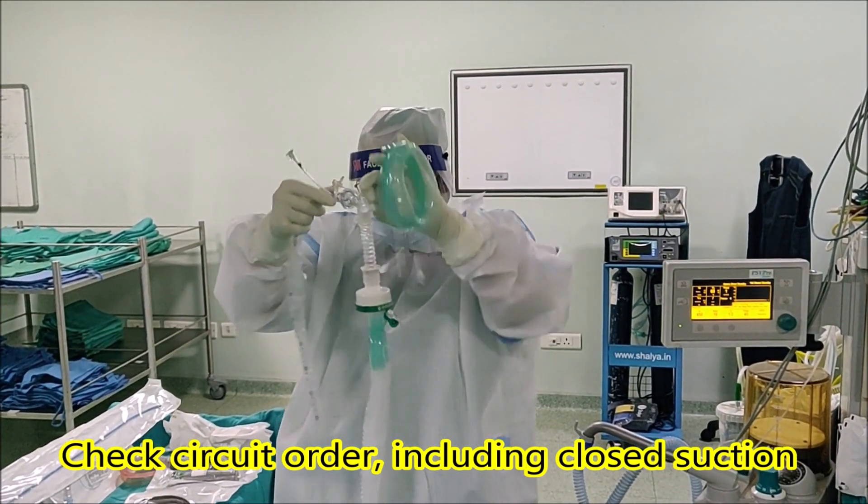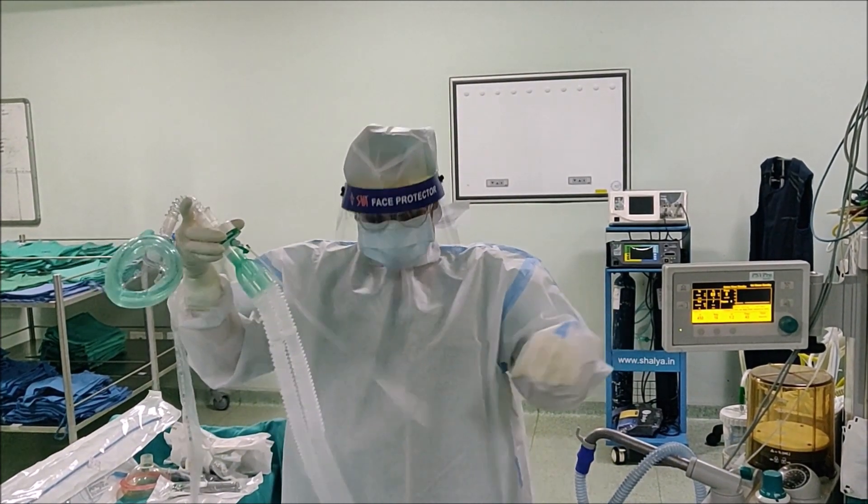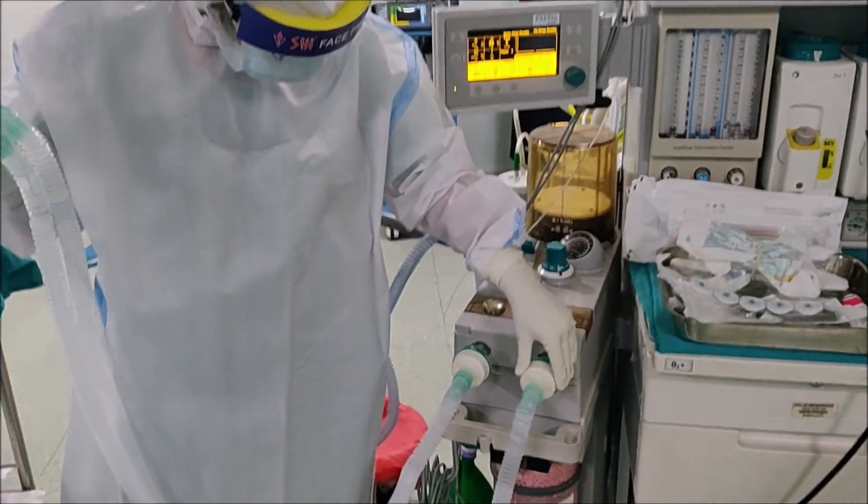Mask, close suction catheter, HME filter with capnography, circuit, two HME filters at the inspiratory and expiratory limb at the machine end.